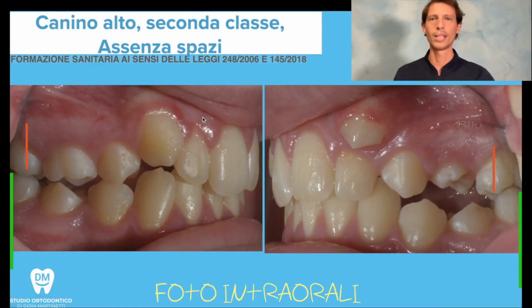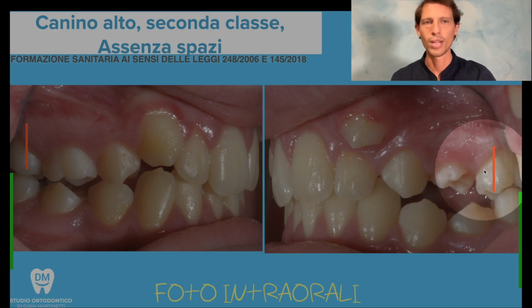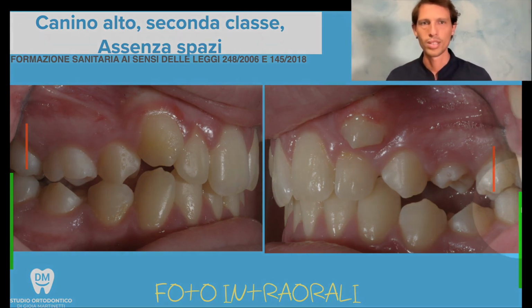If we look at how the teeth fit together, you can see that the one marked in green is correct, while our tooth is at the level of the red line. We say that this patient has a class 2 bite, meaning the upper teeth are ahead. They're ahead by a whole tooth compared to the lower tooth, which is the worst possible situation. There's nothing worse than this. The bite couldn't be more wrong, with the back teeth coming forward like this. In other words, this red should be where the green is.